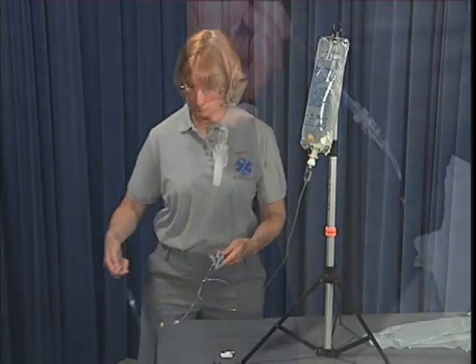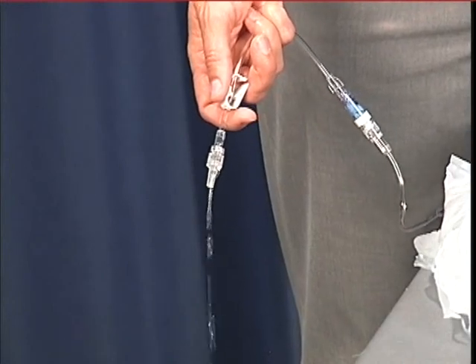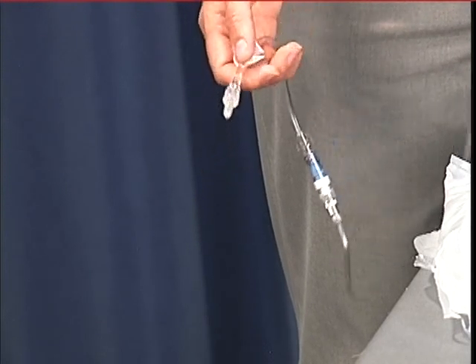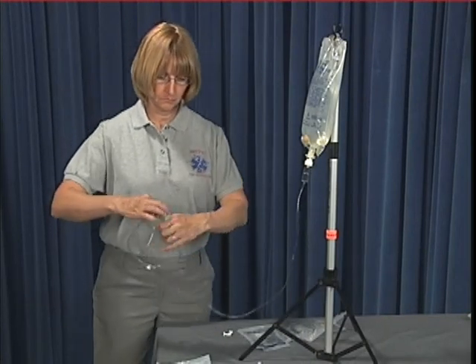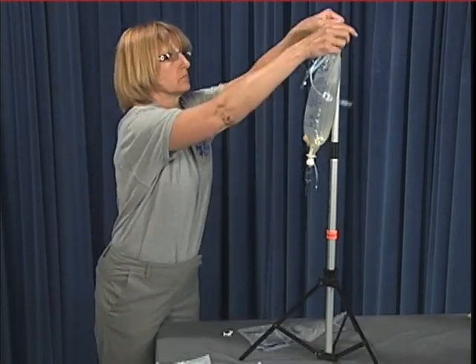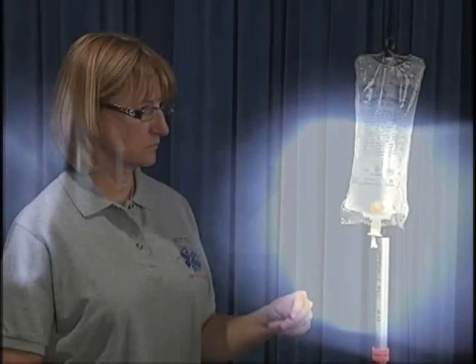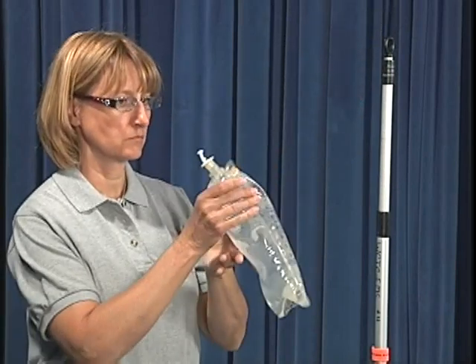Open the flow control clamp and allow the IV fluid to completely fill the line. It is often necessary to invert or flick the med ports to remove larger air bubbles. Once the line is completely filled with fluid, close the flow clamp and place the primed line in position for use.